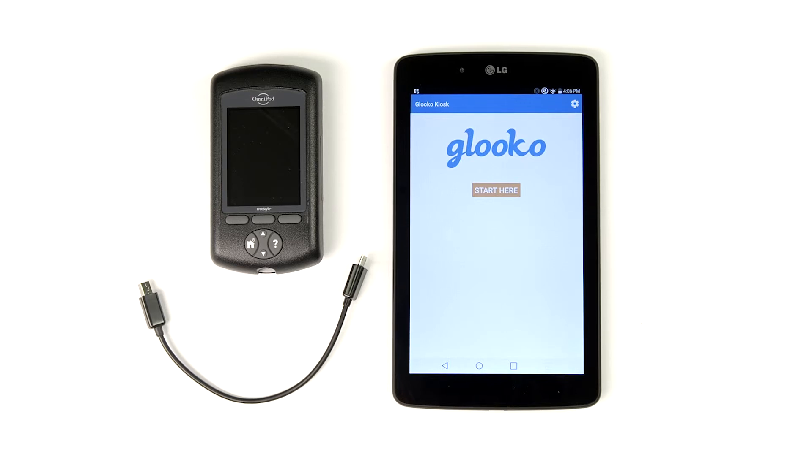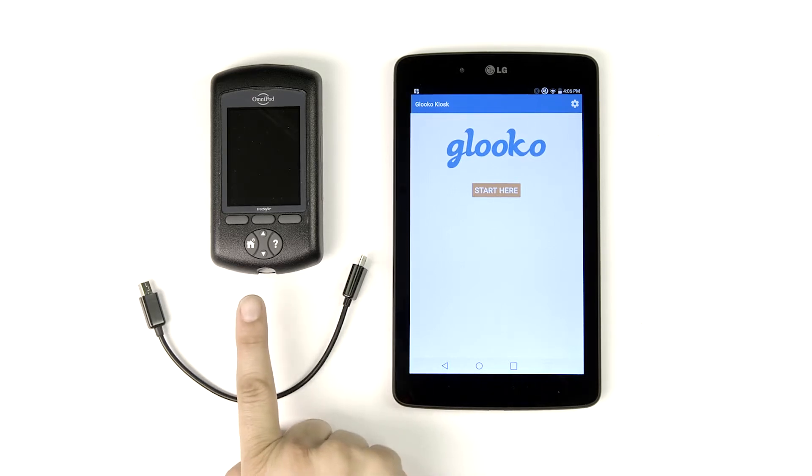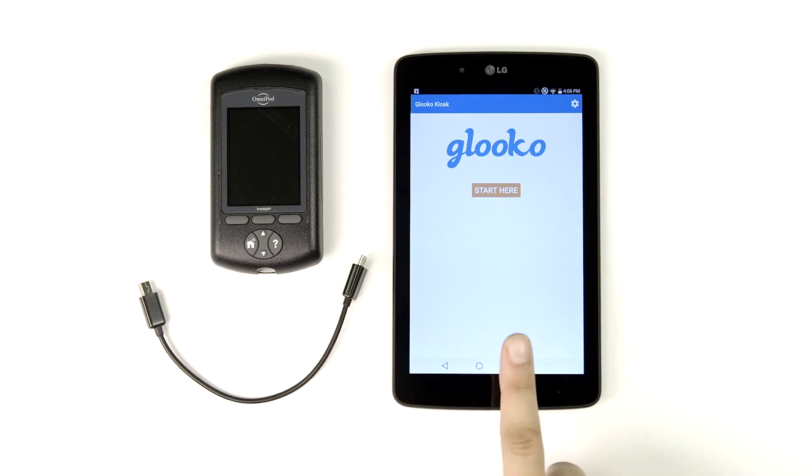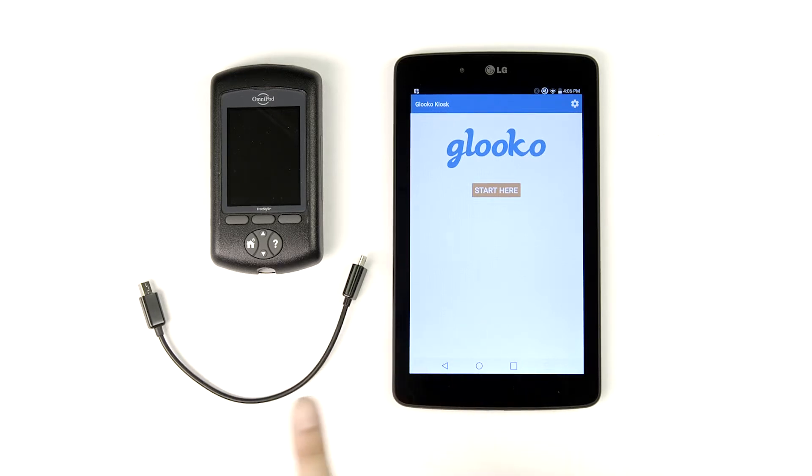In order to do this, you'll need an Insulet Omnipod, an Android tablet with Glooko Kiosk installed, and a micro to mini USB on-the-go cable.